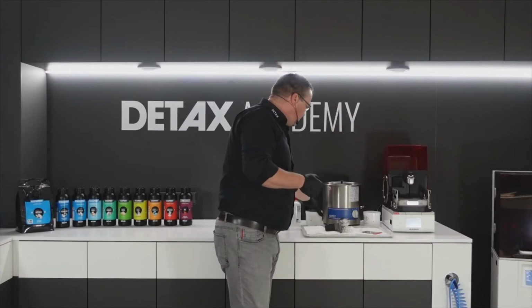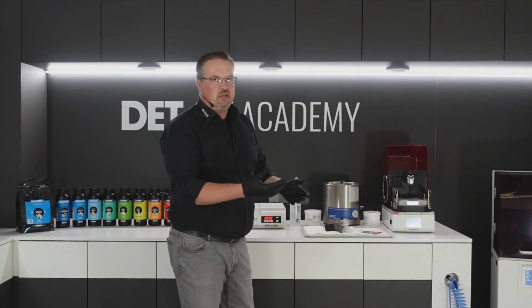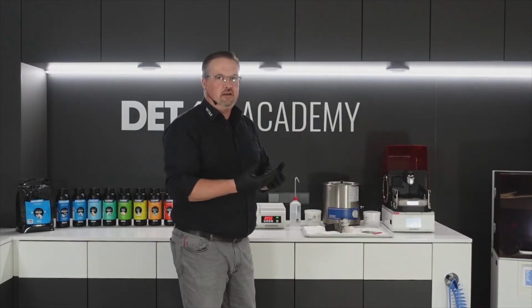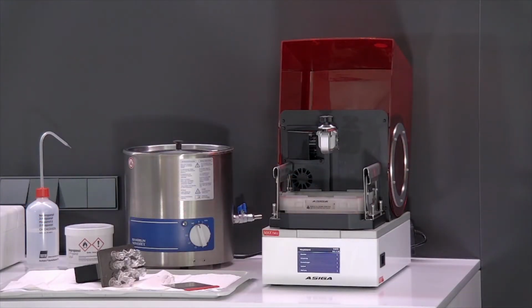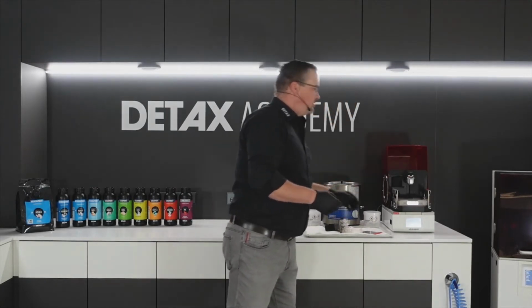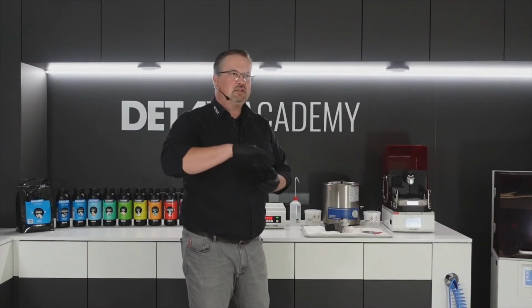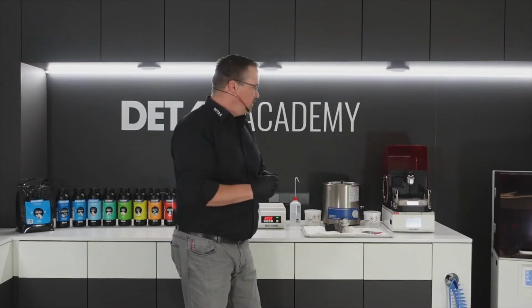After that, we take it out and blow it with compressed air to make sure it is inside and outside clean and dry. And then we use the other box. This is marked with B. I hope you can see it. It's marked with B. And inside of the B box, it is clean isopropanol alcohol to make sure that all the rest of the material really comes out of the cast form. Outside, it is not so interesting, but inside it must be cleaned perfectly.